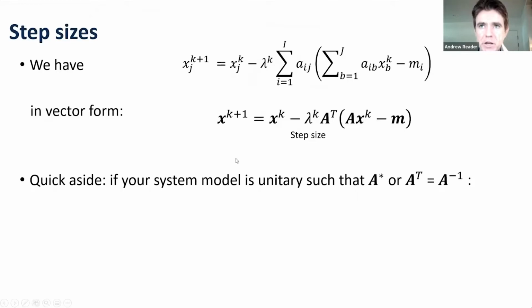Okay, a quick aside here is that if you are in the unusually fortunate position of having a system model which is unitary or orthogonal, I say unitary to account for the MR case where you could have a complex valued system model.